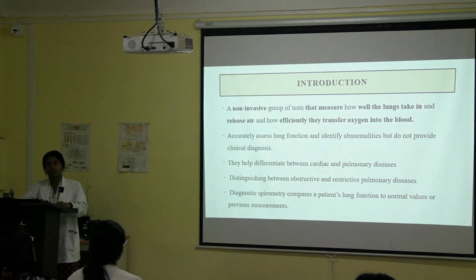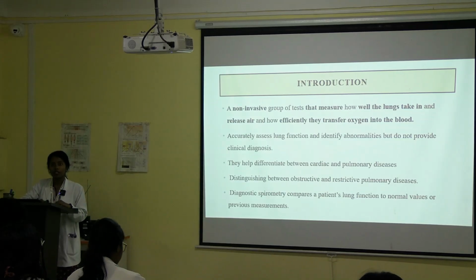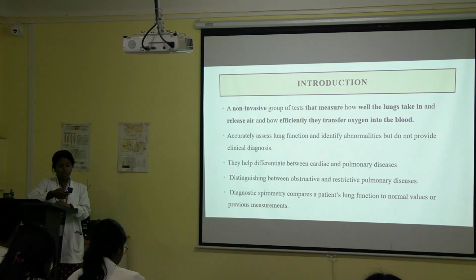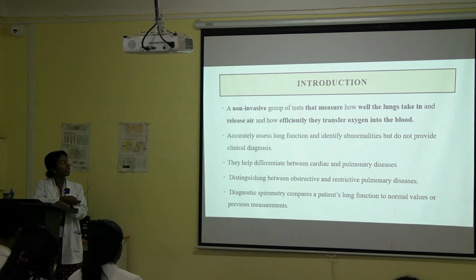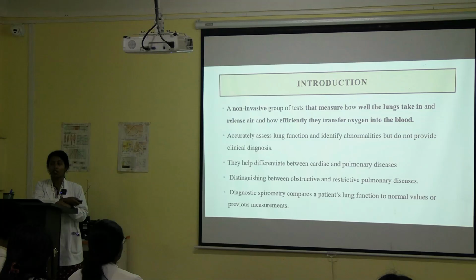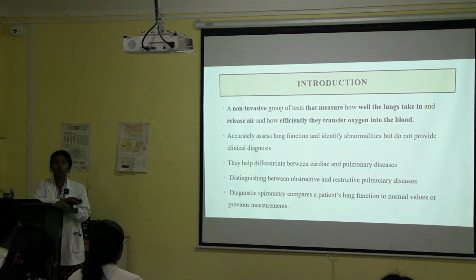So what is lung function test? Another name is also pulmonary function test. So both are the same. These are non-invasive tests. These are a group of tests. They can measure how well the lungs take in and release air and how efficiently they transfer oxygen into blood. So basically we see how well our lung is functioning.